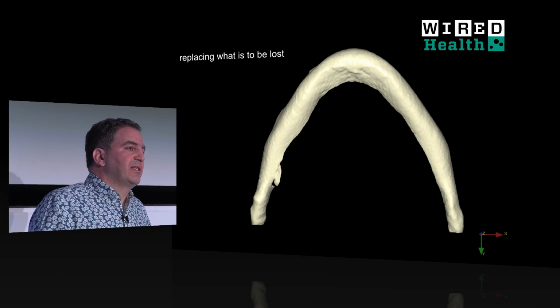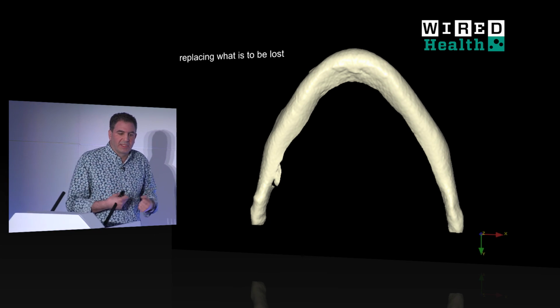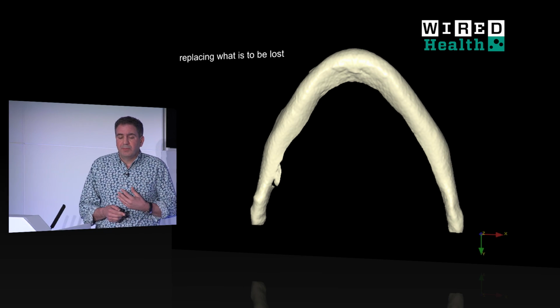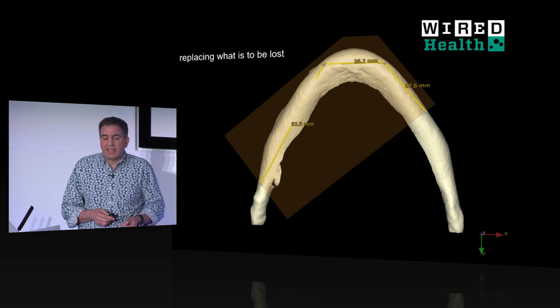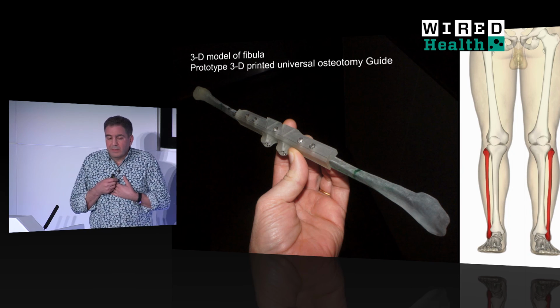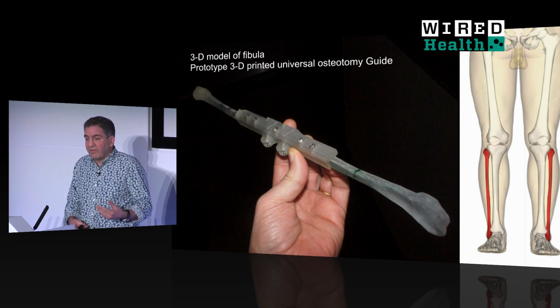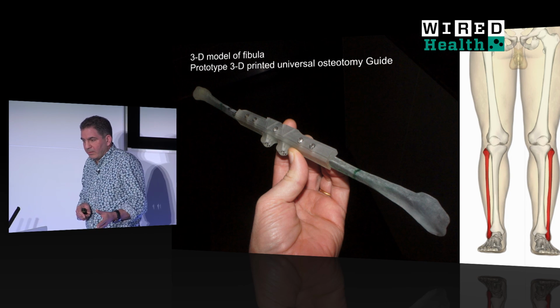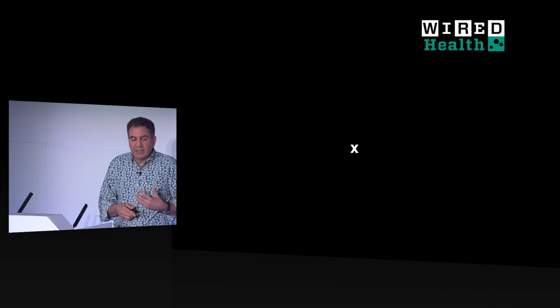And the way that this is dealt with nowadays very often, because we're not growing bone yet, we're not 3D printing bone yet, we will one day, is to take bone from another part of the body. So this is the jaw structure. We can see what's going to be taken away, and we can very simply and crudely measure what needs to be replaced. And how are we going to replace that missing structure? Well, what we're going to do is look elsewhere in the body, and this is a common process, a microvascular free flap, where we're taking bone from the fibula and transforming it into a new jaw form. And what you see there is a 3D print of the patient's fibula and a 3D print of a prototype guide so that we can think about how we can transform this fibula into a functioning jaw.